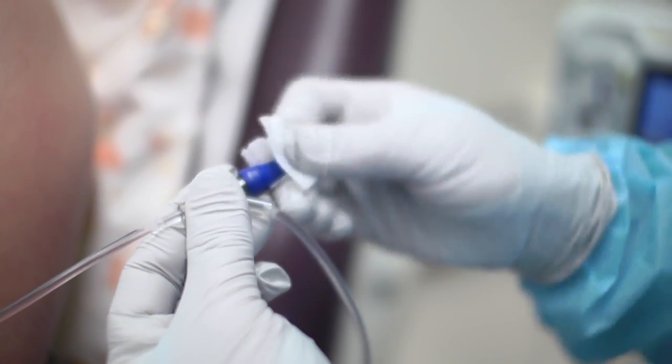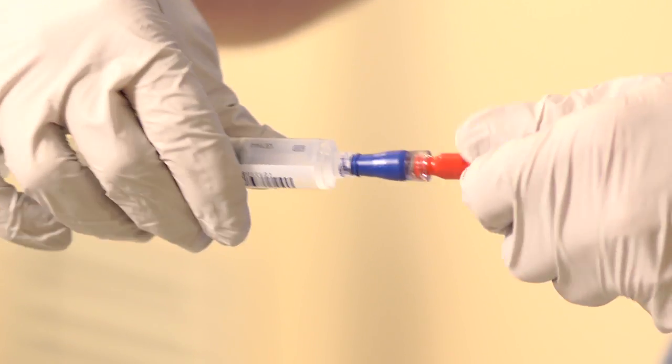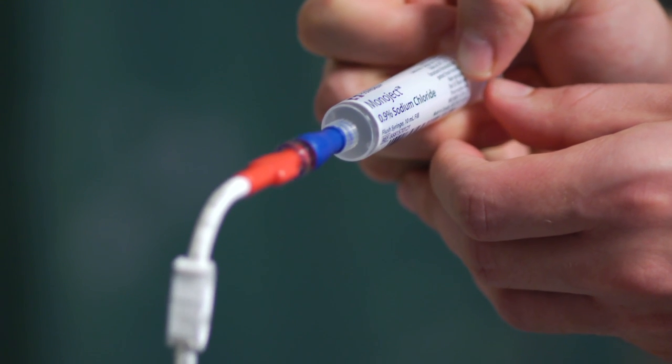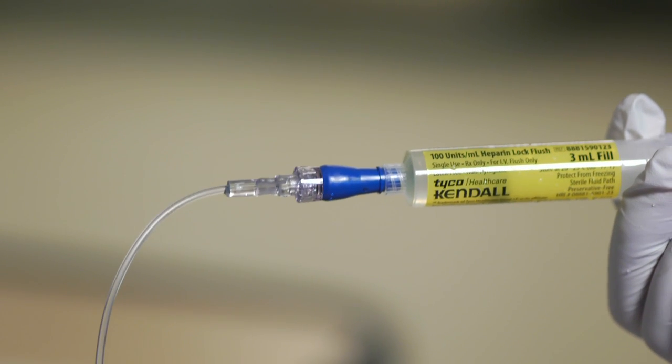Next, the nurse needs to clean the cap with an alcohol pad. The hub of the cap needs to be scrubbed for a total of 15 seconds. After cleaning, the nurse will attach the syringe with saline and unclamp the line, then flush with the saline. It should go nice and easy and it should not hurt. Sometimes patients say they get a funny taste or a cool feeling when the saline is going in. Then the line is clamped and the syringe is removed. If required, your nurse will flush your line with heparin at this time.